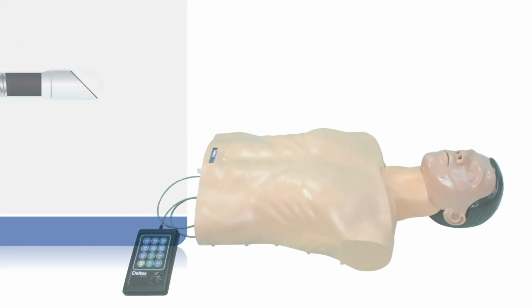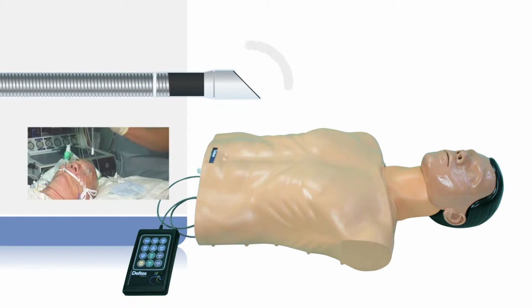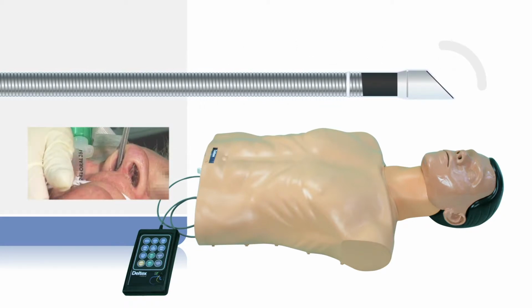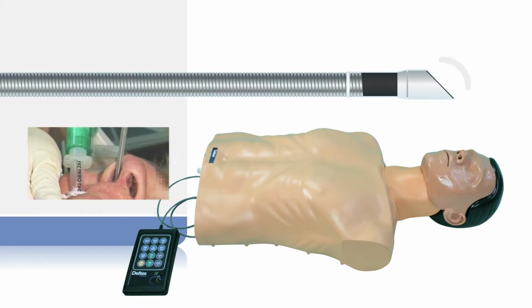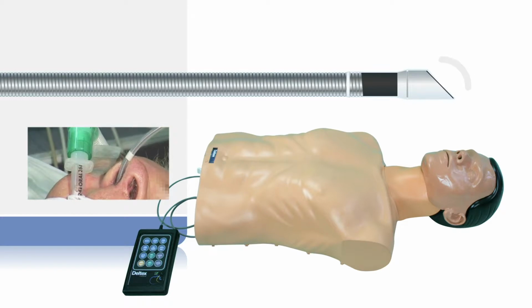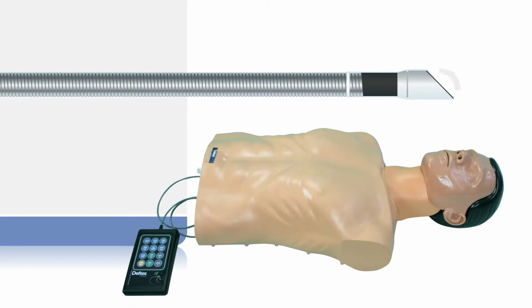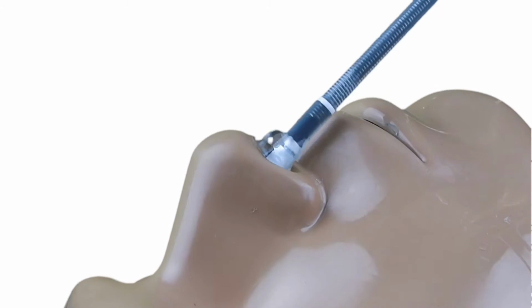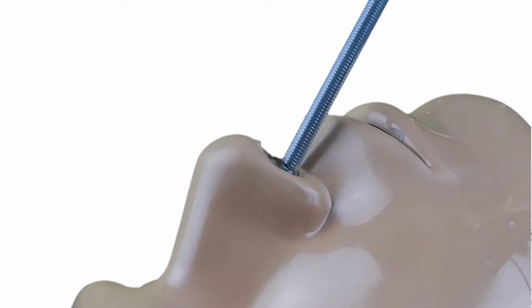This guide to using the esophageal Doppler simulator also includes hints and tips which may be useful when monitoring with real patients. The probe should be placed as early as possible in patients to let a good mucus bond develop. Ultrasound travels poorly through air, so the mucus bond makes focusing easier, which is why the simulator is filled with gel. When placing the probe, hold it with the beveled edge facing up and slowly insert it into the nose.